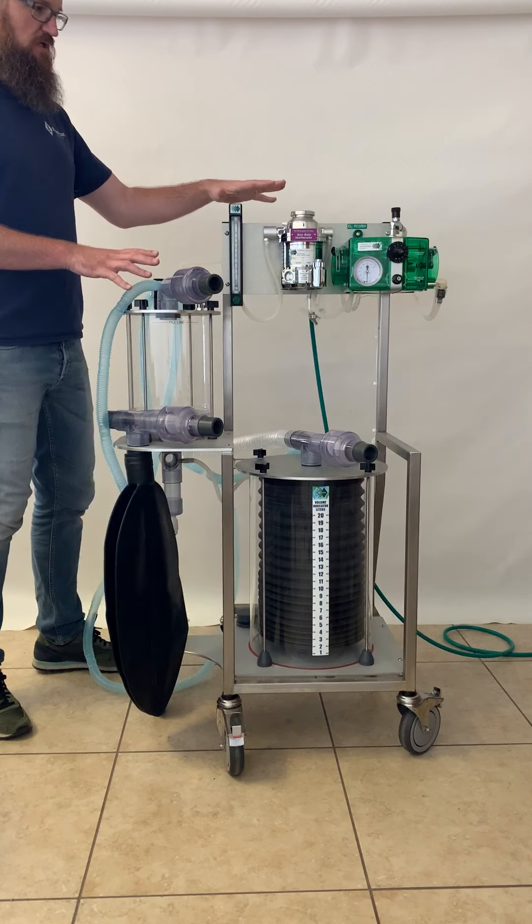Here we have the base machine with the isoflurane vaporizer, 30-liter bag, and oxygen hose. We have a set of breathing hoses — clear corrugated breathing hoses. A patient Y-piece with sampling port for CO2. And a set of endotracheal tube adapters: 16, 20, 22, 26, and 30 millimeter. That is what is included with the machine. There may also be some additional accessories that are purchased with the machine, but that is what comes standard.